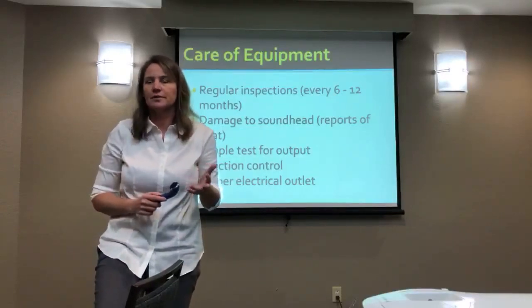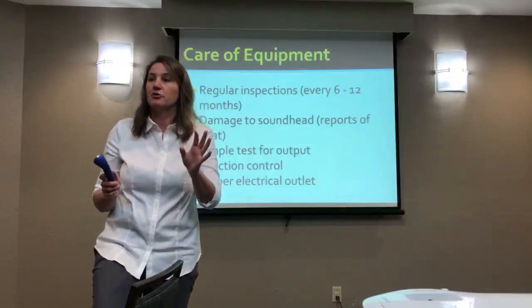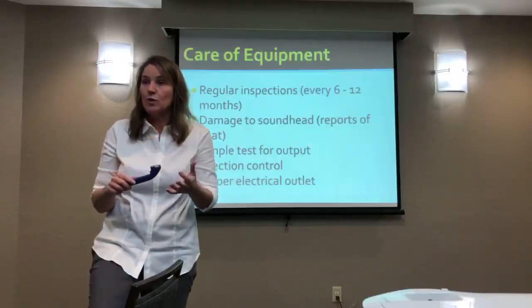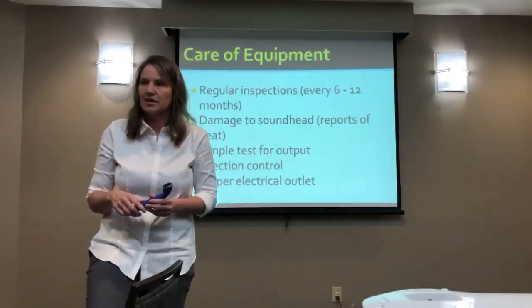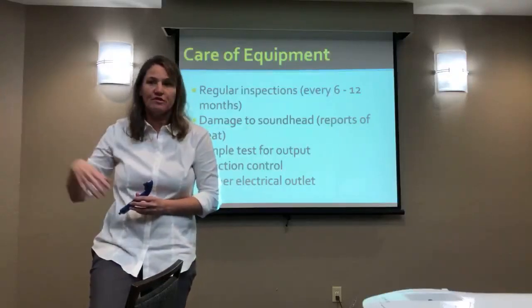I've had cases where somebody said, maybe it's a new building I'd never been in or something, well, we have an ultrasound, but we haven't used it in years. I go dust it off and turn it on and put the water on it and see, does it do anything? And if it's even working, then I can have somebody come in and assess it and calibrate it and so forth. If it doesn't work at all, we either get a new one or I send it to the manufacturer and ask them, what's wrong with this, is it worth fixing?